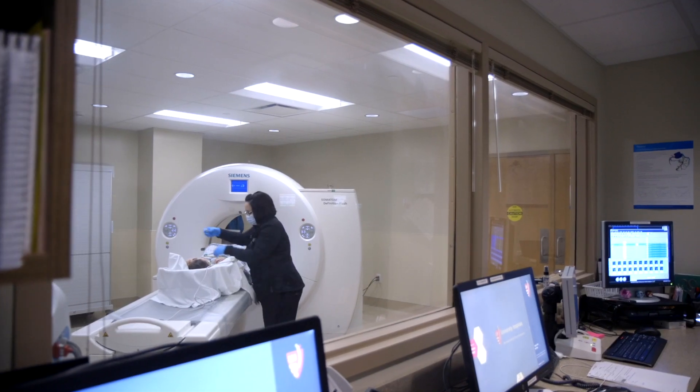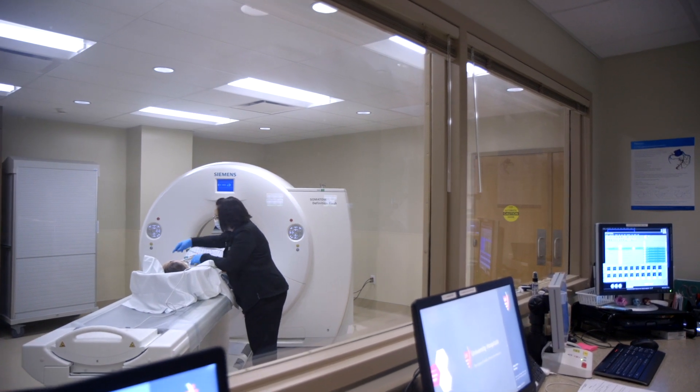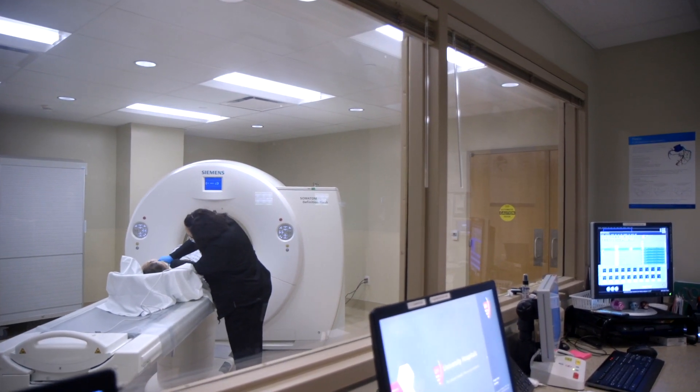A calcium score is a CT scan of the heart. It's a non-invasive test that does not require any contrast agents and it can be performed within minutes. It's designed to detect calcium in the heart arteries, which is a marker of coronary plaque. Coronary plaques are the underlying cause of heart attack in the majority of patients, and being able to quantify the amount of coronary plaque gives us an index of the patient's risk going forward.